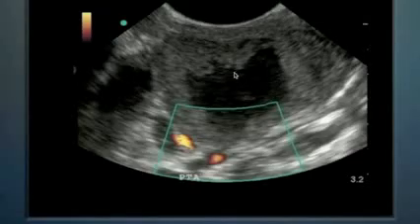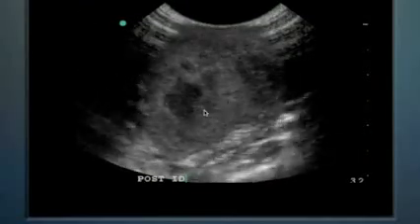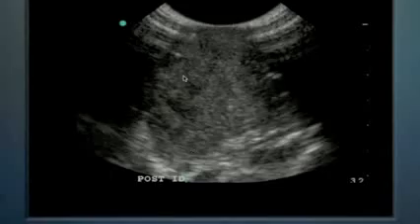Now as the video plays itself, we can see that there's almost complete resolution of this peritonsillar abscess. This is post incision and drainage, and it's essentially gone. So ultrasound is a nice way to diagnose. You can perform the procedure under its guidance and confirm that you have officially ended the procedure as well.